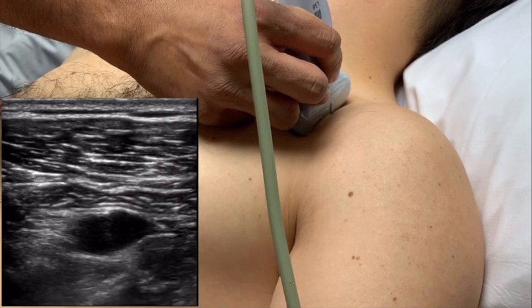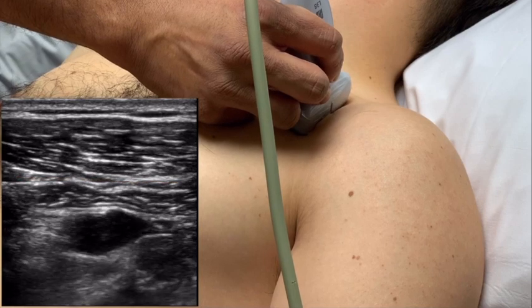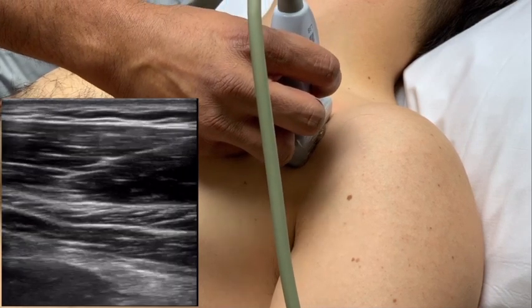A PECS 1 block is performed in this plane between pec major and pec minor. And as you slide laterally, a PECS 2 block is done below the pec minor.